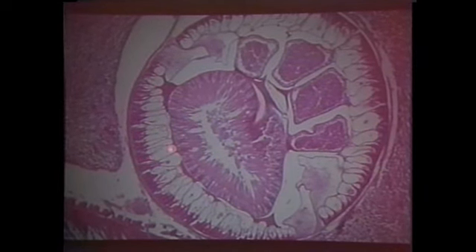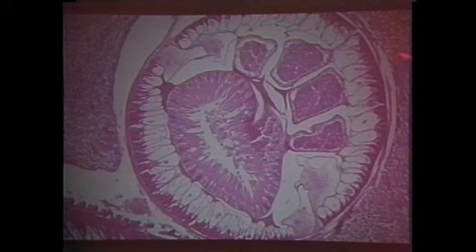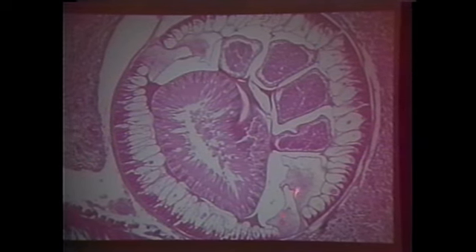This is Spirocerca. Pretty muscles, huh? Coelomyarian, you can see the contractile portion and the cytoplasmic portion. The intestines are composed of cuboidal to columnar cells with a large microvillar border. And what sex is this? Female. And look at the lateral cords, how strange they are. They're sublaterals, but they're just not symmetrical as you've seen before.